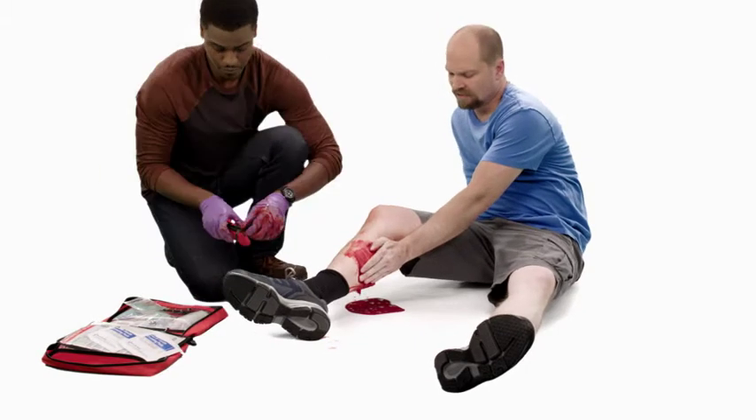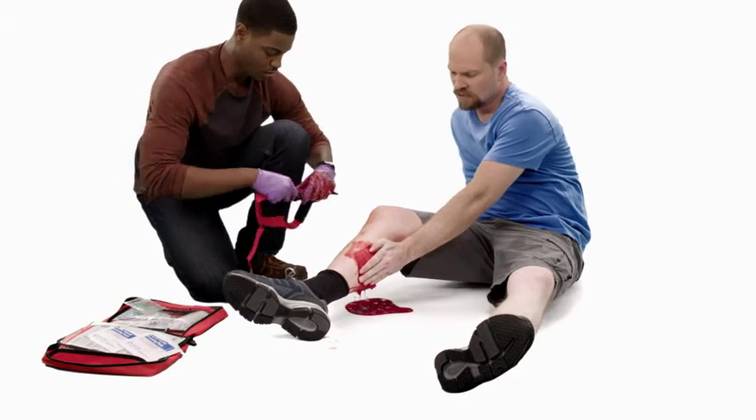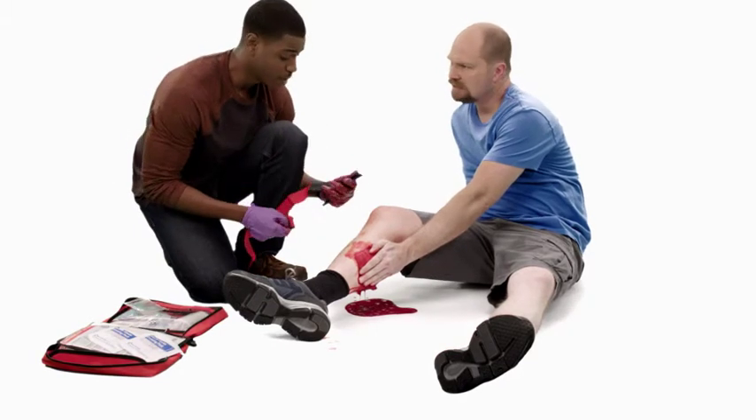Tourniquets can be painful. If you must apply a tourniquet, make sure the person understands the reason for the tourniquet and warn the person that it might be painful.